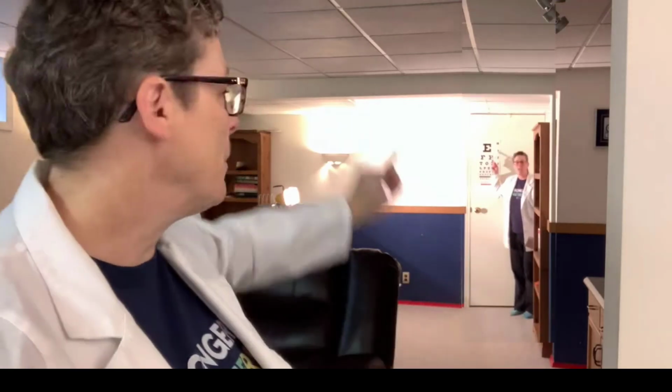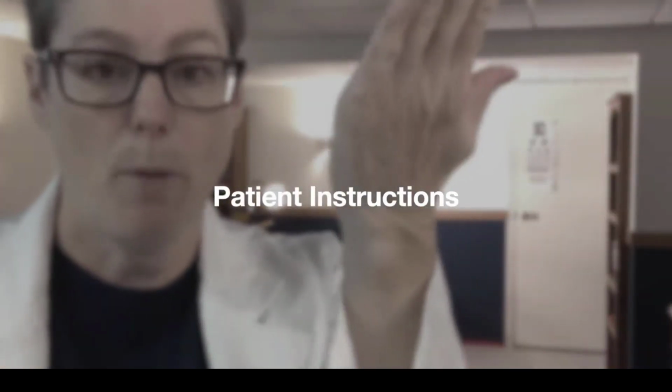Now, as your patient is standing at the 20-foot line, you're going to be pointing at different areas on that map and asking them to read the line that you point to. But we're going to do it one eye at a time, so you'll want them to cover up their eye with either the palm of their hand or a piece of paper so that there's no cheating, because if they use their fingers, they can see through, and then that might skew your results.